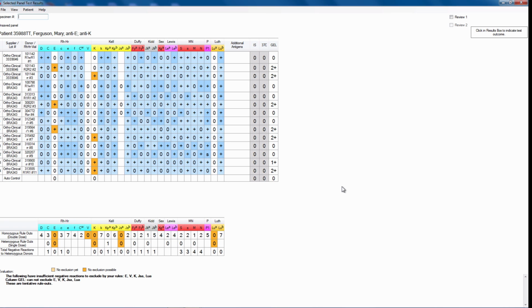We showed you this workup without using check cells or any secondary testing methods. These issues and many others are addressed in our video library.